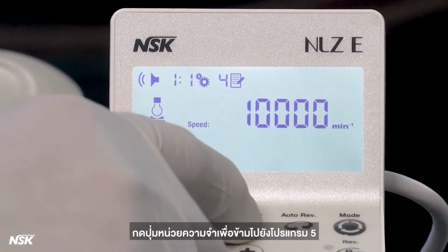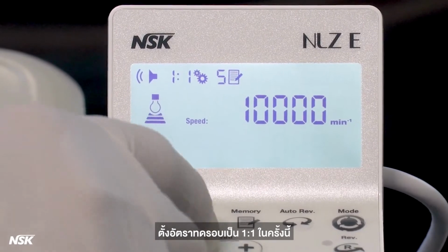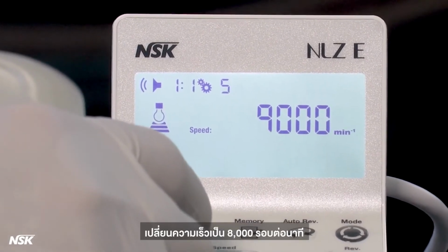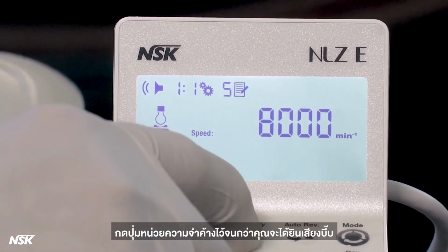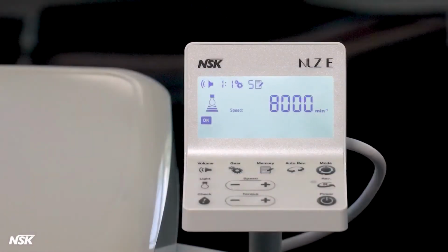Press the memory button to jump to program number 5. Set the gear ratio to 1-to-1 this time. Change the speed to 8,000 RPM. Press and hold the memory button until you hear a beep. The setting is stored as program number 5.